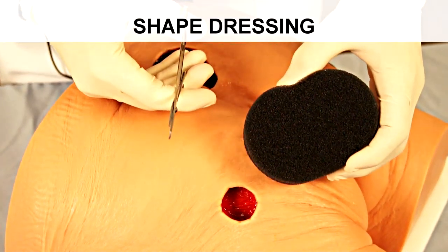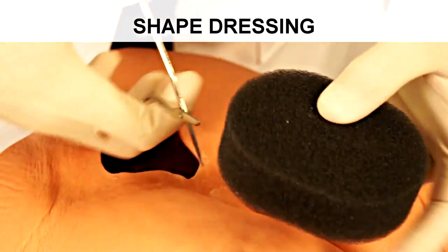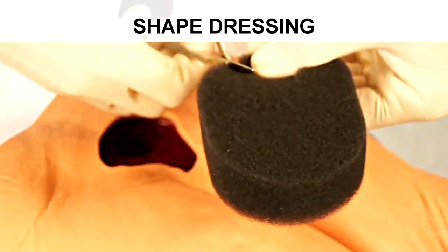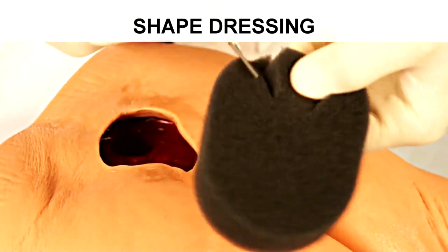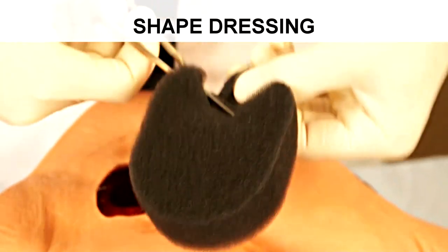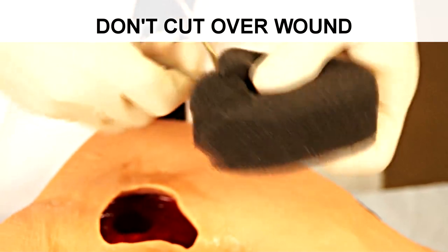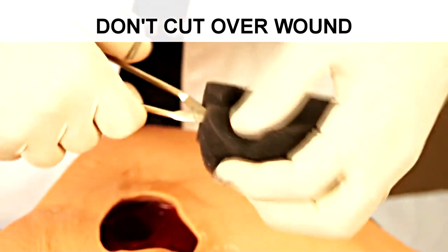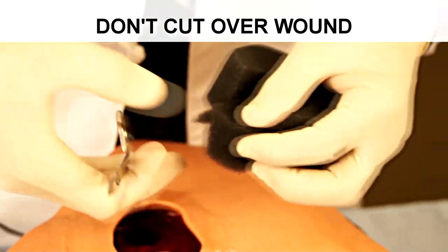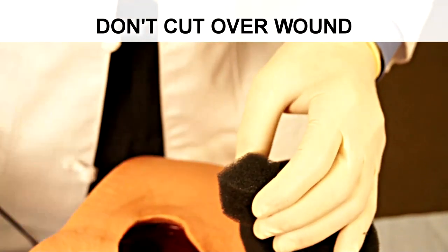We can now begin to cut the foam dressing to a size that is slightly smaller than the wound. It is important to cut the dressing over a clean surface and not over the wound, so that particles of the foam dressing do not fall into the wound.